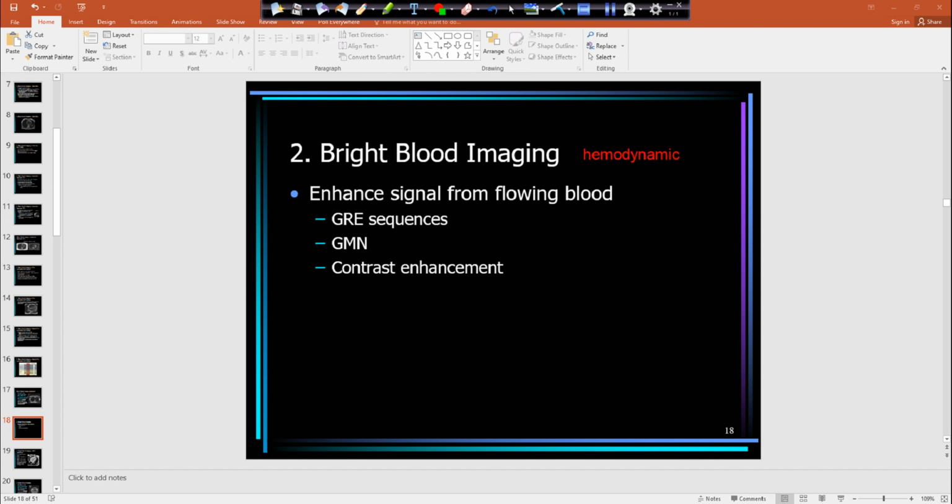Our contrast is gadolinium based, and due to its property, it can either be linear, meaning the gadolinium isn't completely encapsulated by its chelate, or it could be macrocyclic, which means it's completely encapsulated. The macrocyclic agents are more stable, and there's big controversy about gadolinium deposition going on, and those usually result in less tissue deposition of gadolinium.